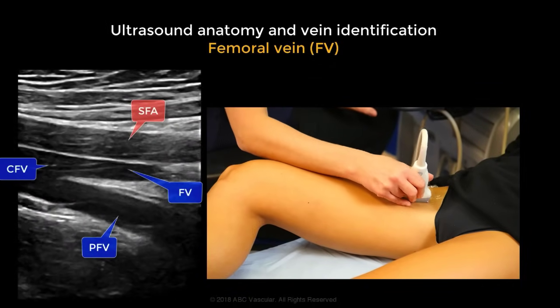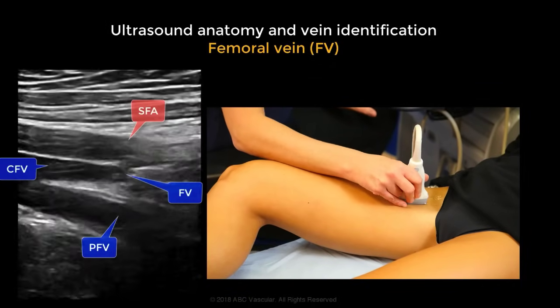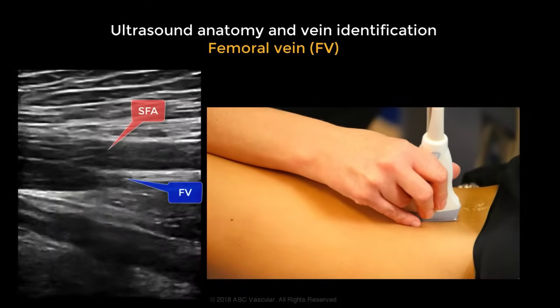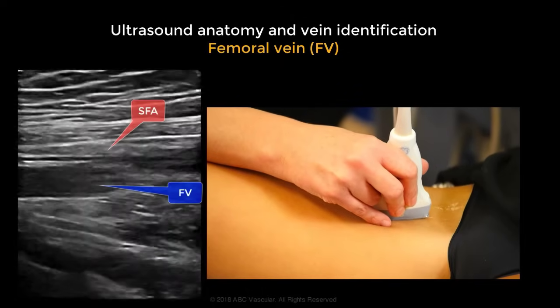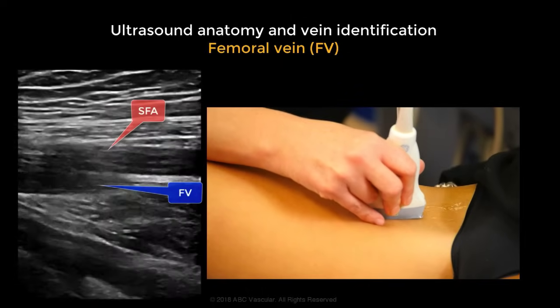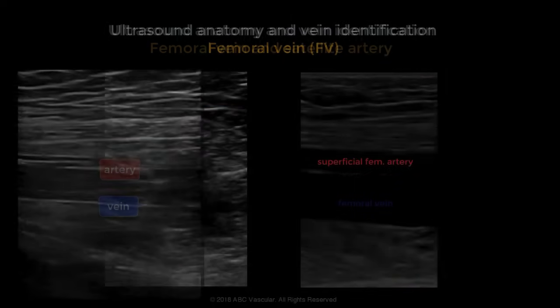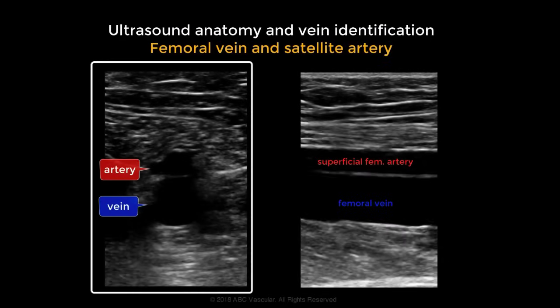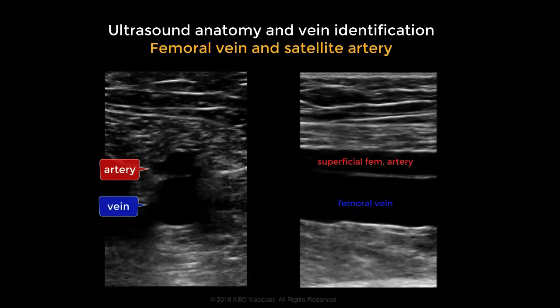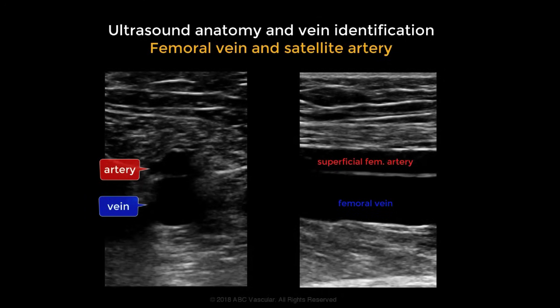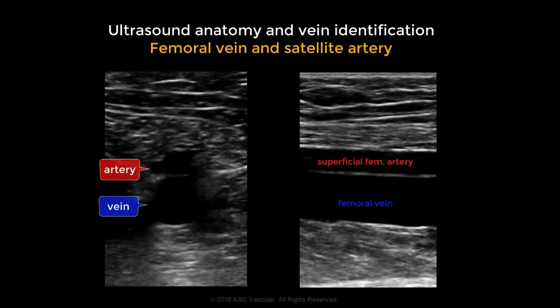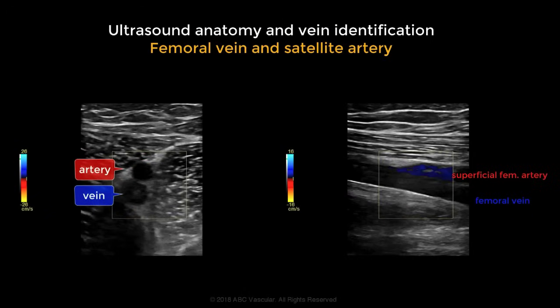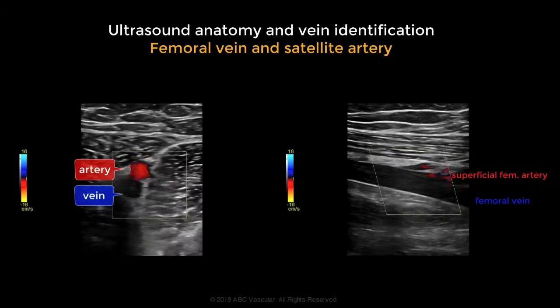From this level, move the transducer further down distally into the thigh to identify the femoral vein. The femoral vein lies posteriorly to the superficial femoral artery, and you can appreciate this both in cross-section and longitudinal views. This is an important landmark especially in the presence of pathology; therefore we have arterial flow superiorly compared to the venous flow.